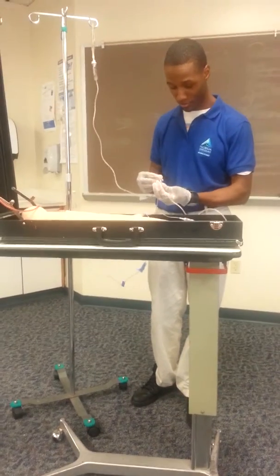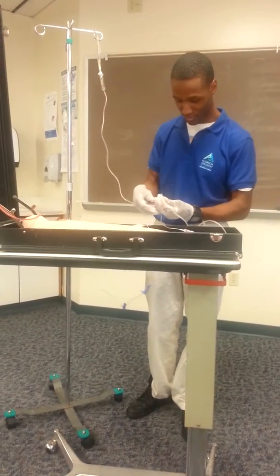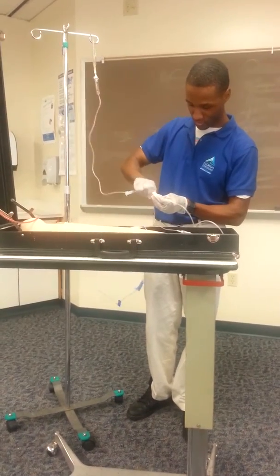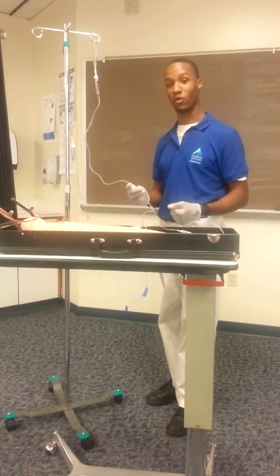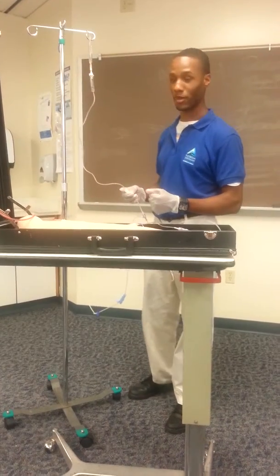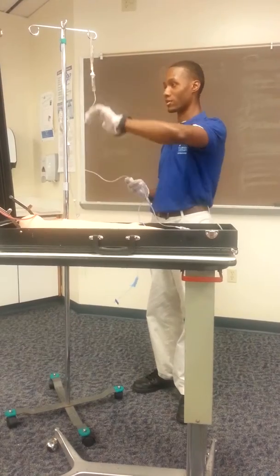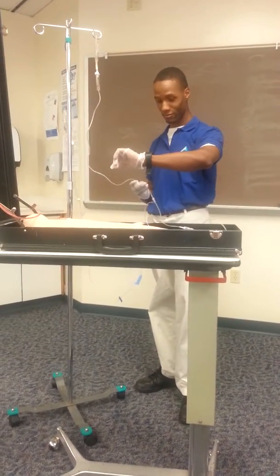I would clean off the port and attach, and I would establish the flow rate of 4 drops per minute as already calculated. Fine. And establish the drop rate.